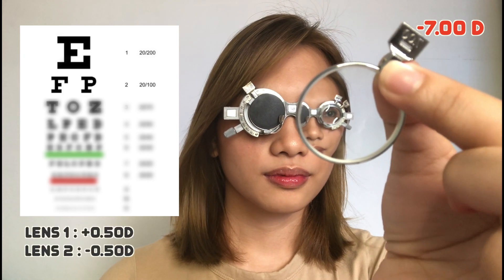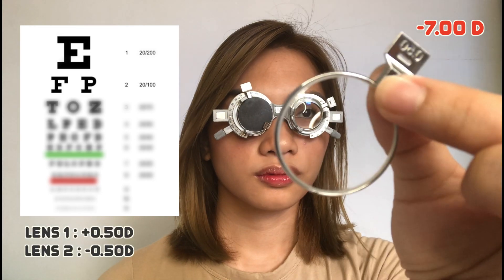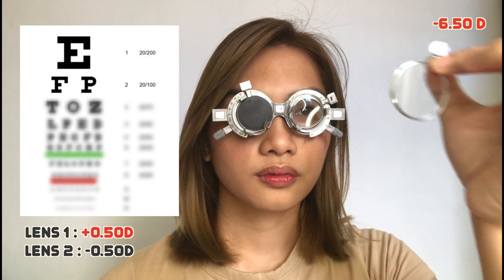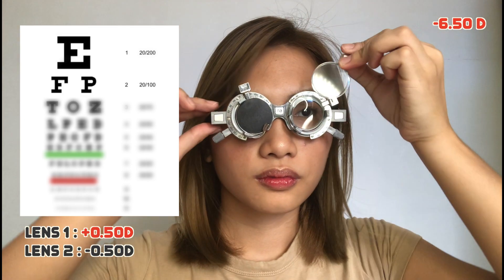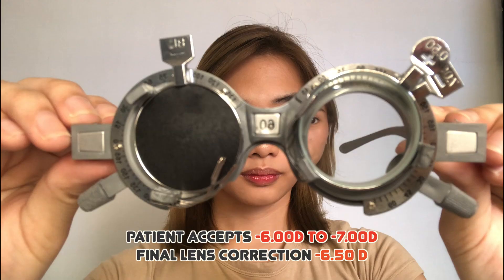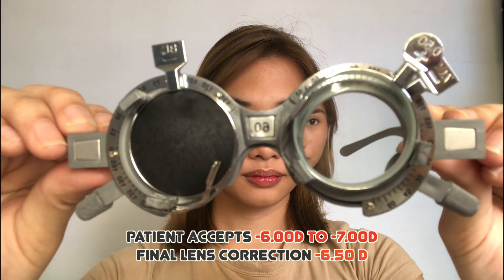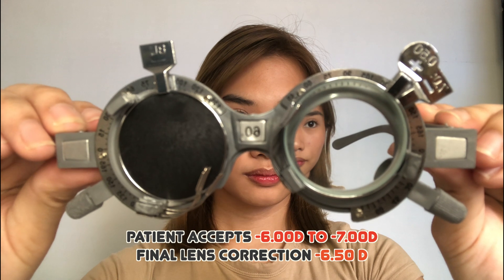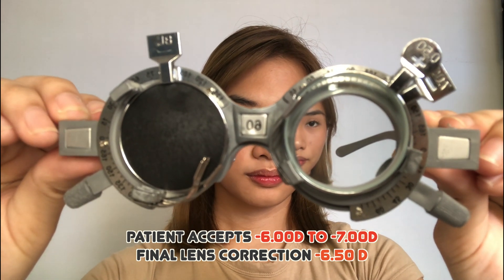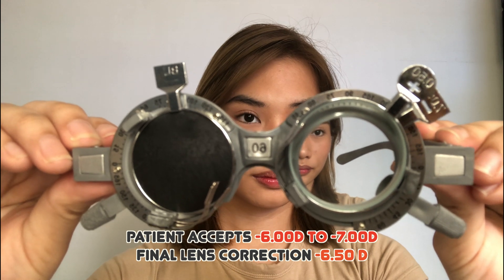Ask the patient which lens is better — Lens 1 or Lens 2? The patient chooses Lens 1 and can now see the 20 over 70 line. The patient accepts between minus 6 to minus 7 diopters. Therefore, we can refine minus 6.50 diopters, between minus 6 to minus 7 diopters, to get the best sphere.